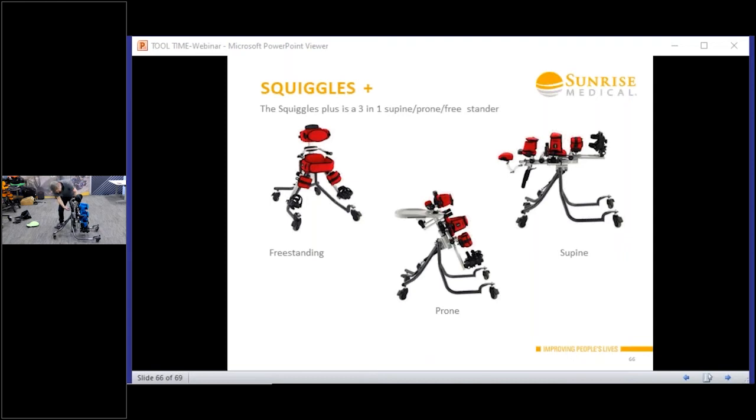So at the moment, this is in its lowest. What we've got here is angle balancing. So then we can set the height higher as they grow. So there's a main spine that you manage the overall height, and then you adjust the leg length accordingly. So very similar to the MYGO seat. Okay, you can't pull these all the way off. They will stop that from happening. So we can manage leg length discrepancy and setup here.